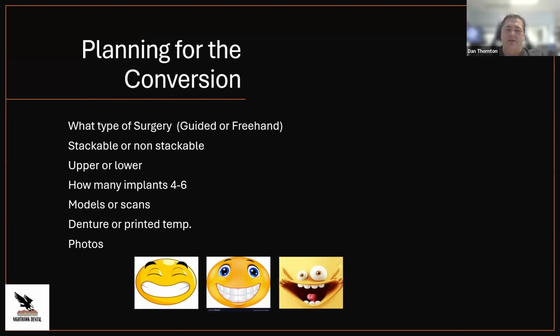And a lot of times they'll actually look at you for what you need to make the case better at the end. So the best thing to do is, when you start doing a couple of them, you'll get a little bit more experience underneath your belt, and then you'll feel more comfortable talking to the doctors and the surgeons about saying, yes, can you turn that implant one way? Can you move that abutment a different direction? Can we do this instead of that? Can we reduce a little bit more bone here, a little bit more bone there? After a time, you start getting a little bit more familiar with it, a little bit more relaxed with it, a little bit more confident, might as well say.